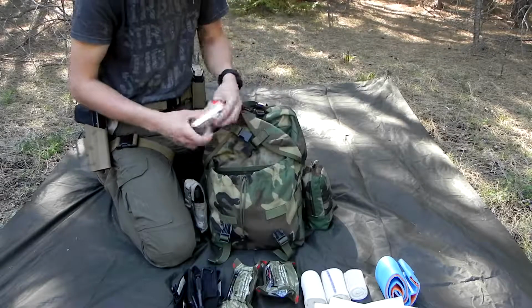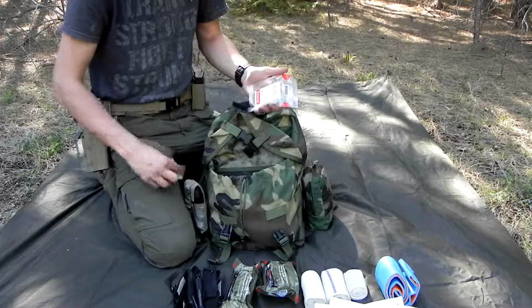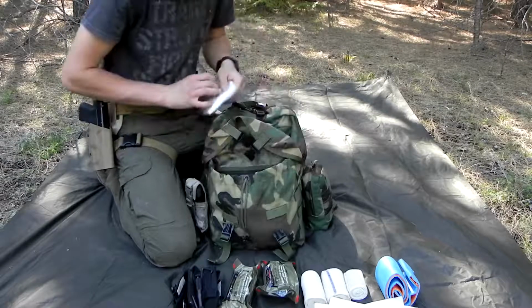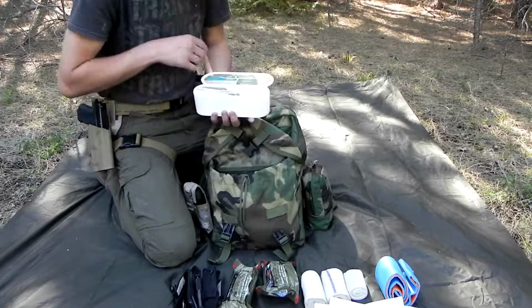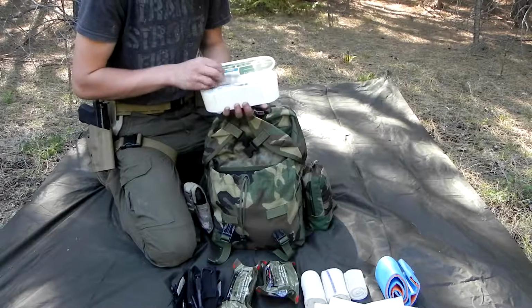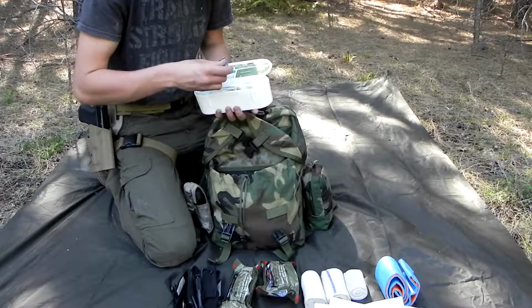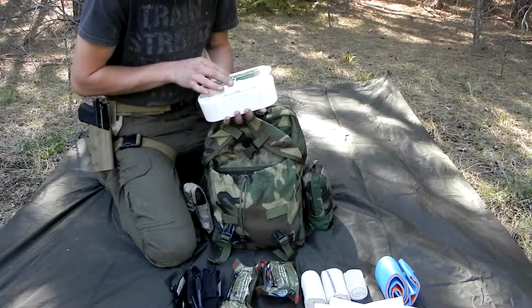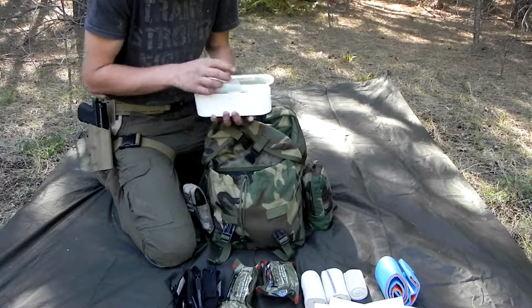And then for packing wounds, I have just, it's not a hemostatic agent, it's just a compressed gauze. I have 2 of those. And then I have a triangular bandage. And then I have some basic band-aids, and I think this is acetaminophen, or, because I have some allergy medications in here too. Yep, this is the allergy stuff. And then band-aids and basic stuff like that for wound closure, and antiseptics.